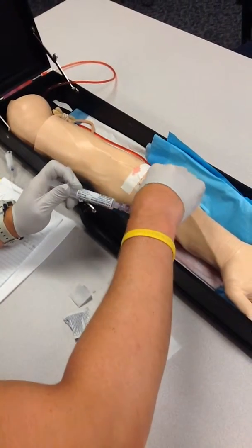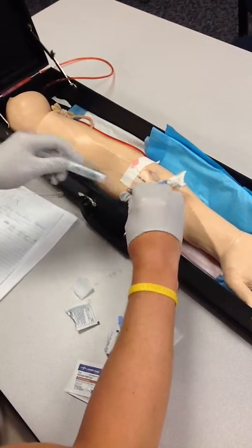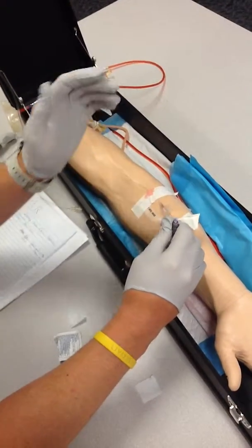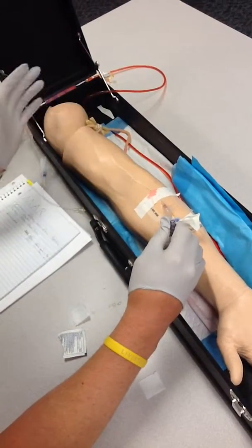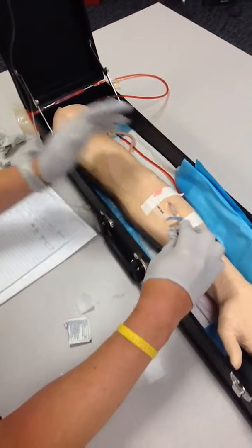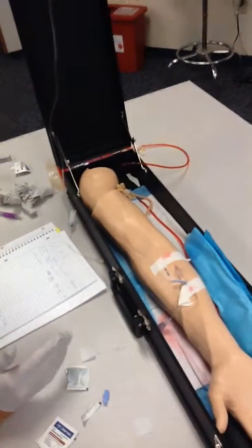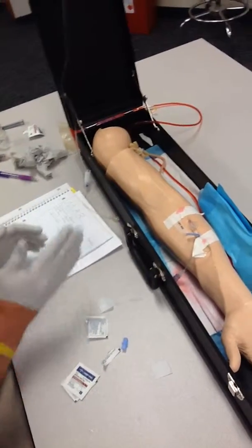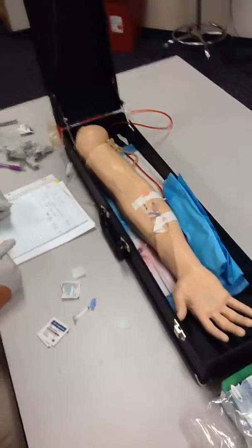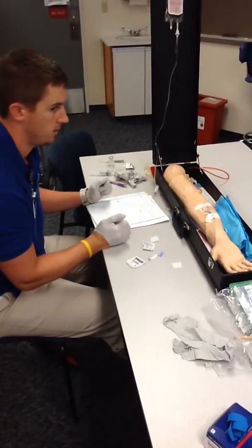At that point, I will lock the pigtail, remove the vial, and ask how they're doing, if they're in any pain, if they have to use the restroom now, if they want any of their personal belongings a little closer to their position, the pain level as before. And if they don't need anything, I will then make sure I finish all my documentation of what was infused: the time, the date, the dose, the route, the site, and how the patient reacted to the administration.